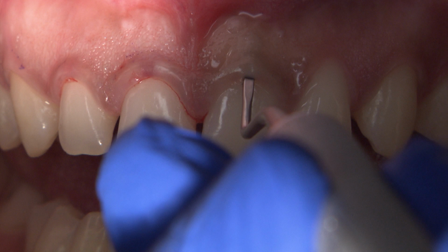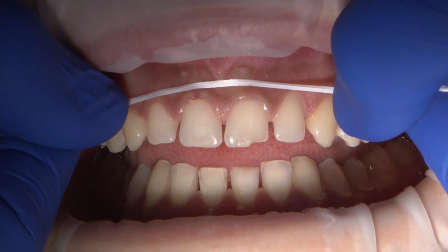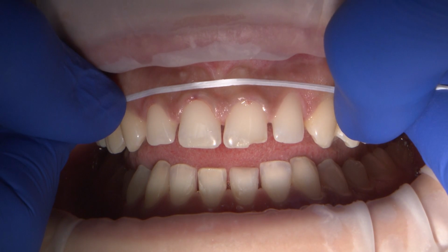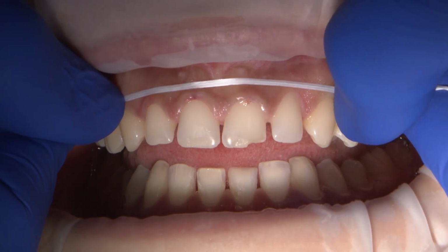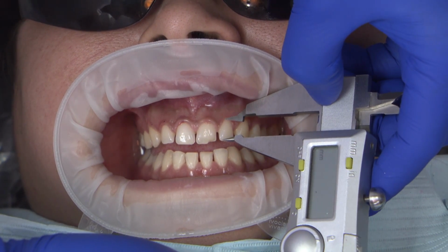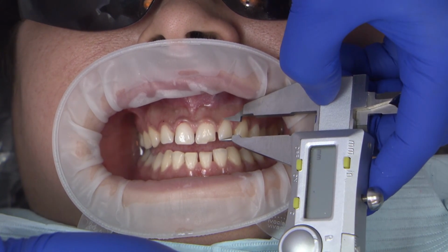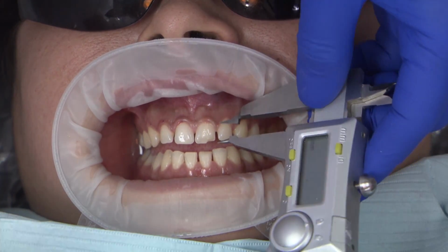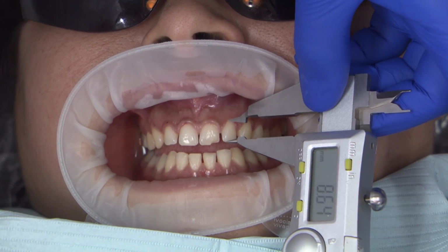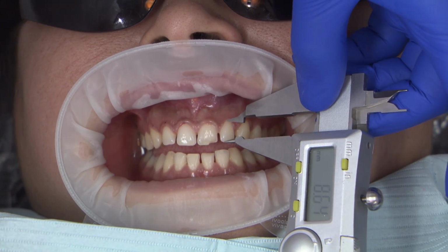For these patients, the sulcus depths on the facial range from 5 mm to 6 mm with the CEJ hidden under the sulcus. For this reason, I don't need to raise up a flap and create osseous resective surgery to assess a new biological width. Instead, I can use my Picasso Lite diode laser to safely remove 2 to 3 mm of excess tissue to improve the pink aesthetics.